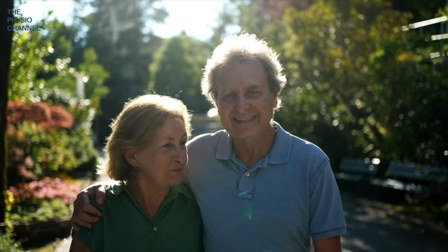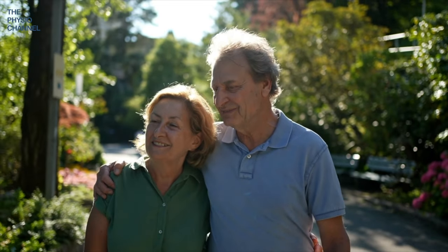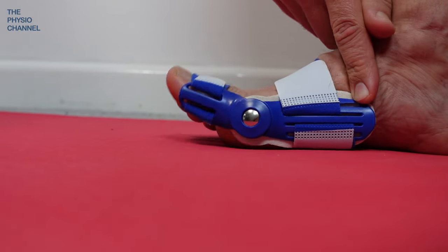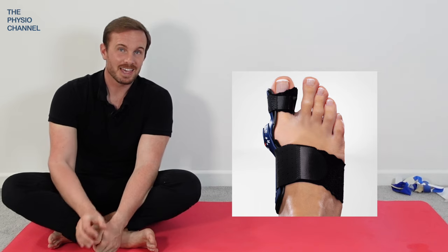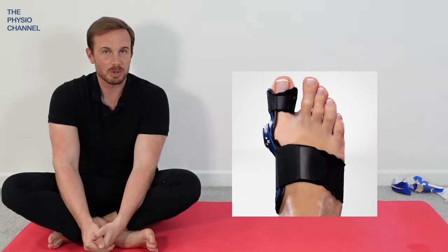However, research does support the use of these orthoses to help reduce pain. So even though the position of the toe may not be corrected to any noticeable degree, the reduction of pain makes these devices certainly worth trying. These orthoses are cheap, easy to get hold of, and you can try different types to find the most comfortable one.